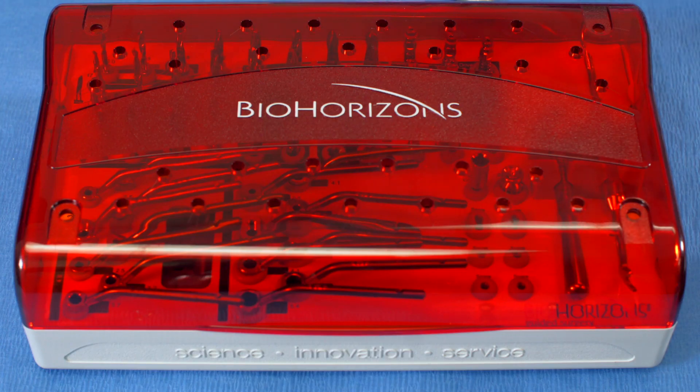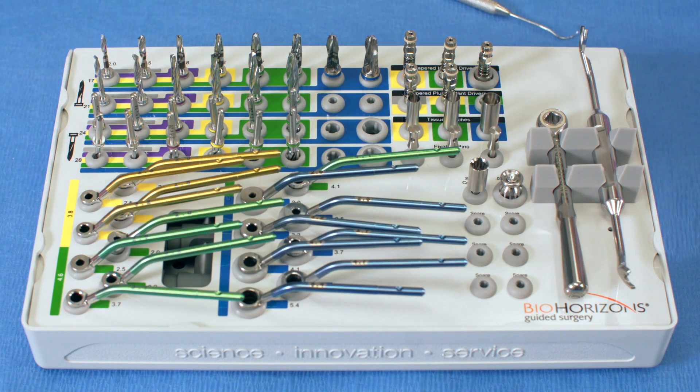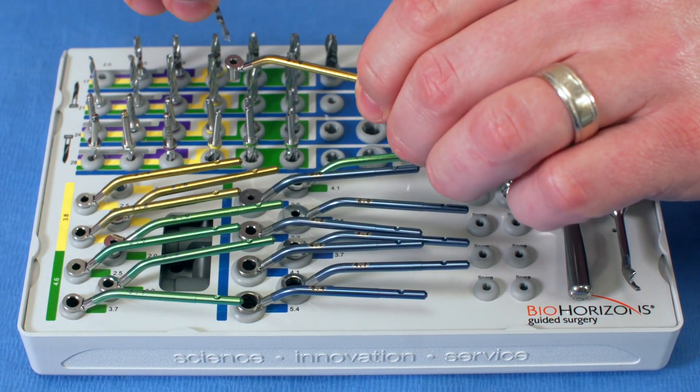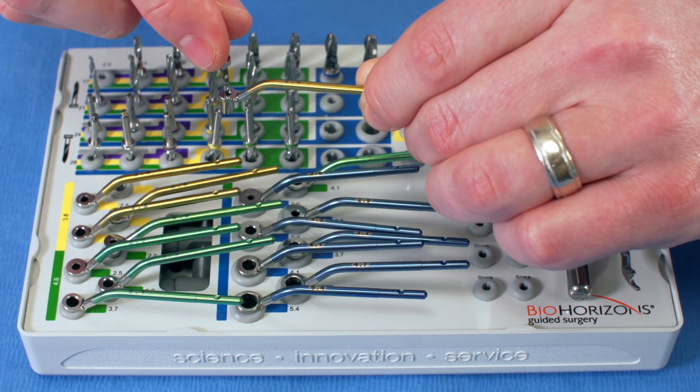Now we're going to review the Tapered HD guided surgery kit. It comes in the same type of autoclavable box with a removable lid. The difference with this drill system is it's guided — meaning you can place your drills and implants through a surgery guide. It's a key system, where guides move you through different implant drills using that key. The kit still includes 2.0 and 2.5 initial osteotomy drills, and the same 2.8, 3.2, 3.7, 4.1, 4.7, and 5.4 drills — but with the guided kit you insert a key into the implant guide sleeve and perform your drilling through that key system.